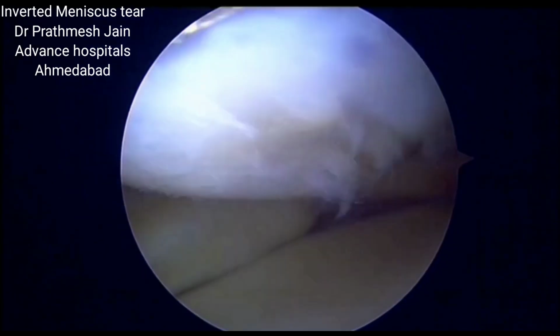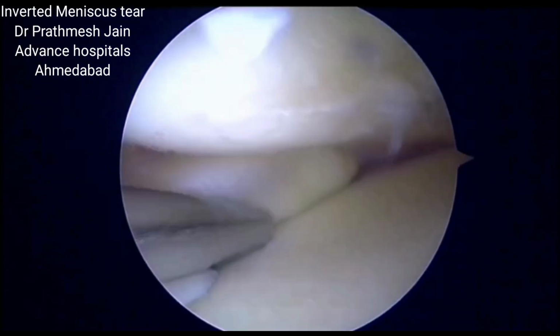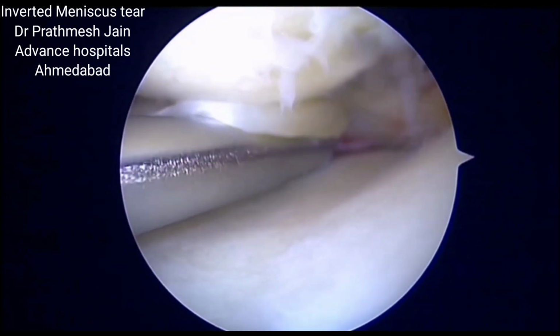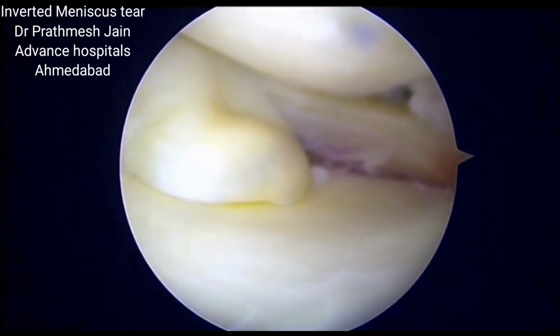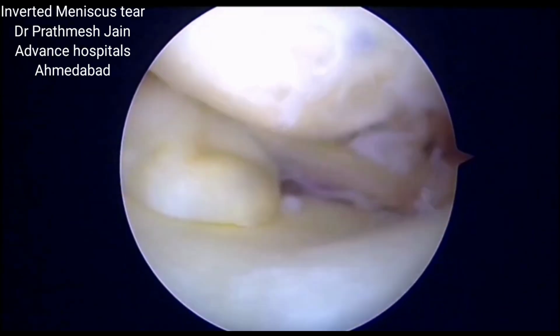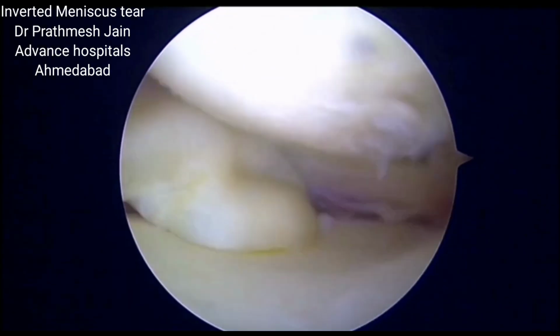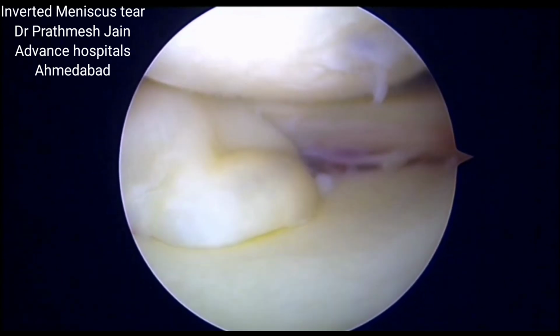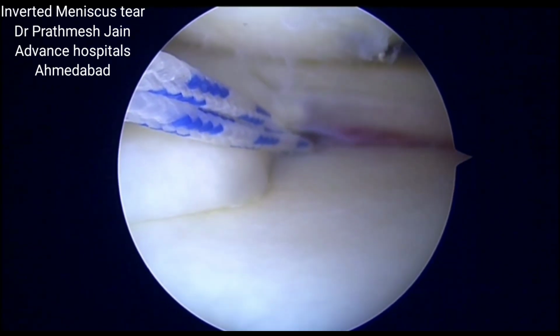Meniscus flap tear, which is inverted in the meniscotibial recess, a very rare pattern of injury. Traditionally this injury was treated with resection of the flap and just trimming of the edges. But now with recent evolution of rootfix anchors, these tears can be repaired into their position.